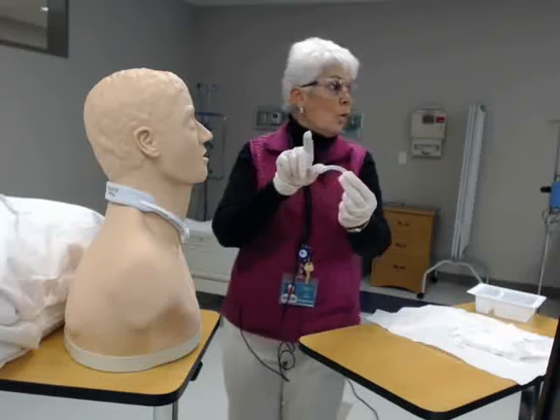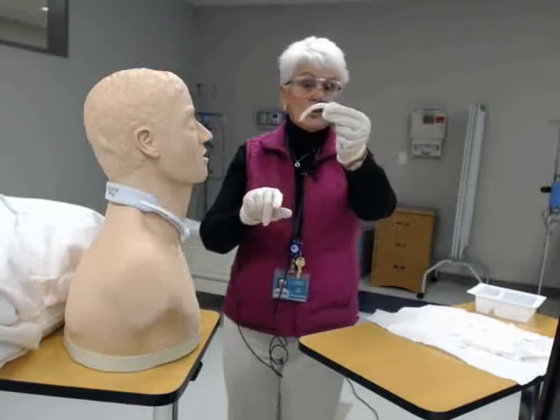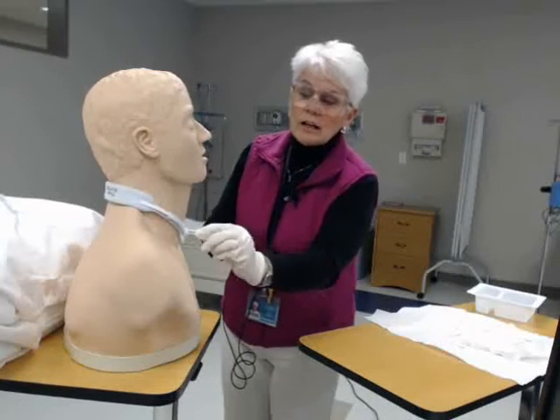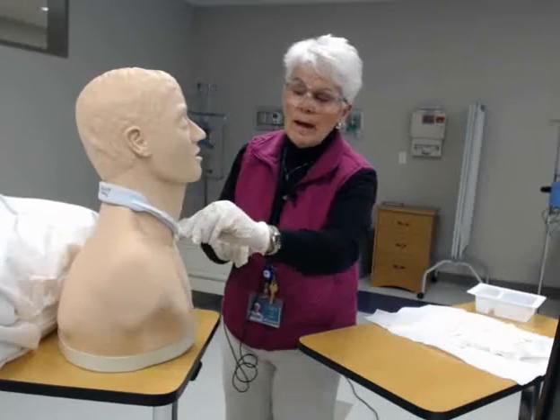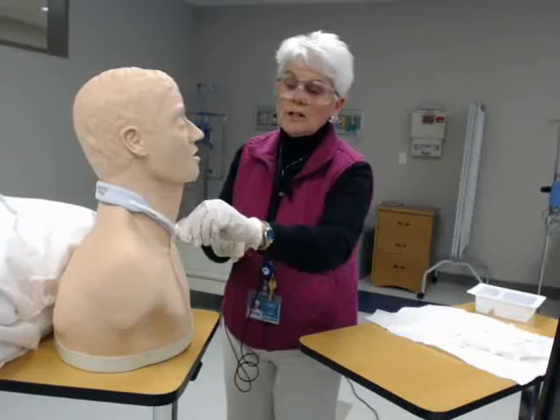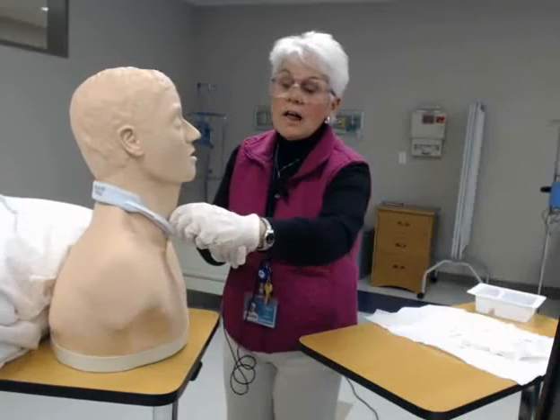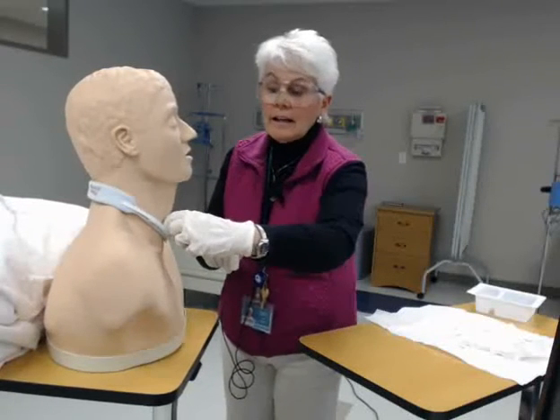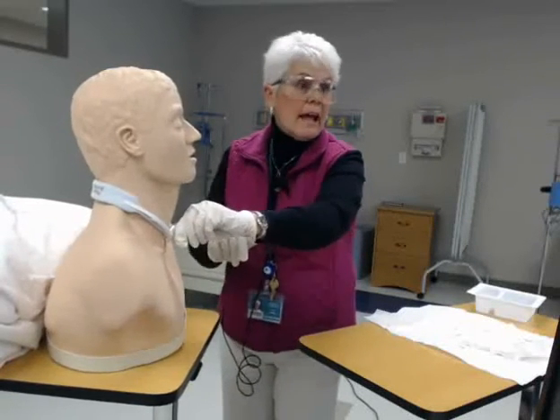The inner cannula is now ready to be reinserted. Take it and go with the curvature — that will align it with the trach. Gently push it back in, then turn it clockwise. When you go clockwise, you'll actually hear it click and lock.